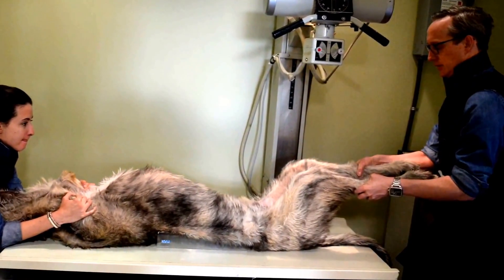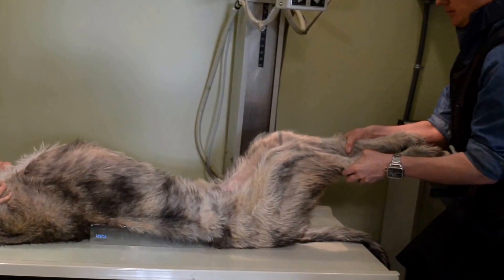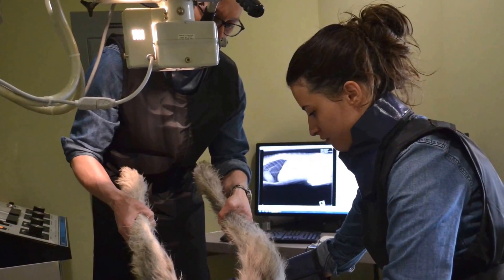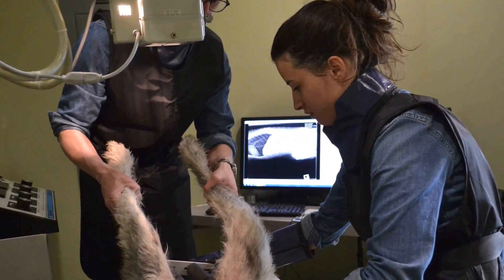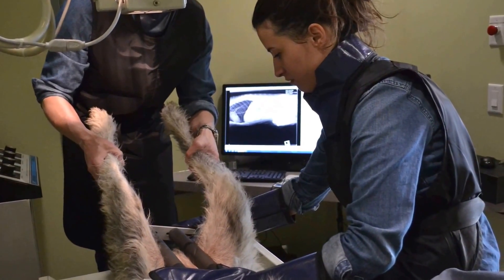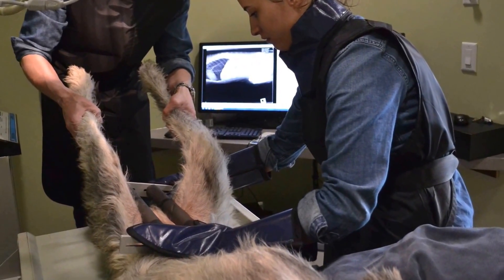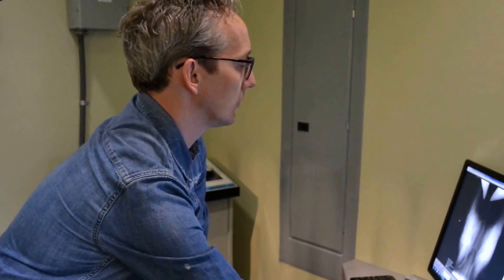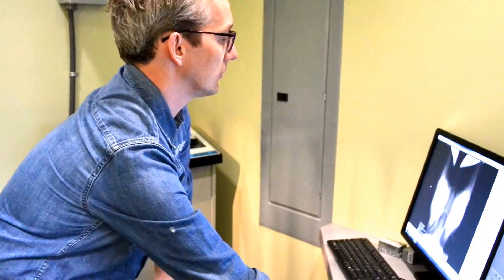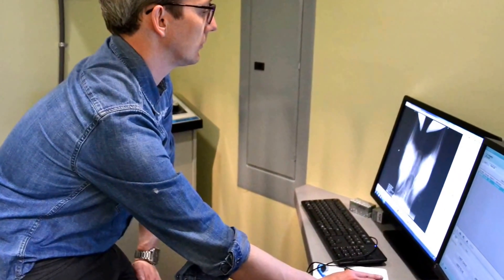The second view is the compression view, which shows how tightly seated the bone can be in the socket. For the third view, we use a device called a distractor, and we place gentle inward pressure on the inside of the legs to form the distracted view, which shows how far the hip ball can sit out of the socket. The x-ray views are sent away digitally to a radiologist who comes up with a numerical score for the hips, which can be compared to other dogs of the same breed.